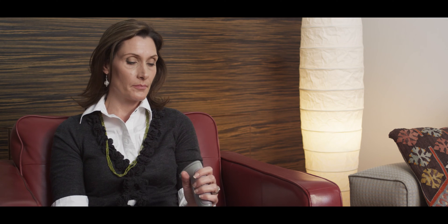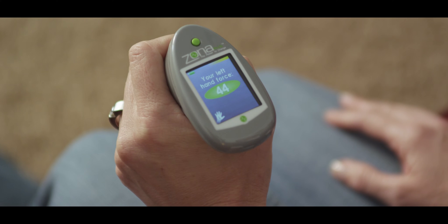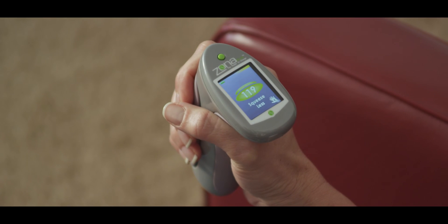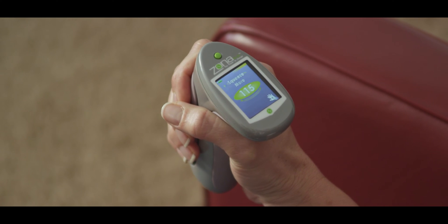Did you notice how the color display guides you through the steps in the change of hands? This initial calibration is very important — it ensures that the following exercise is always done at a safe yet effective intensity level. Now let's start the actual therapy. Starting with your right hand, squeeze at a constant pressure for two minutes.